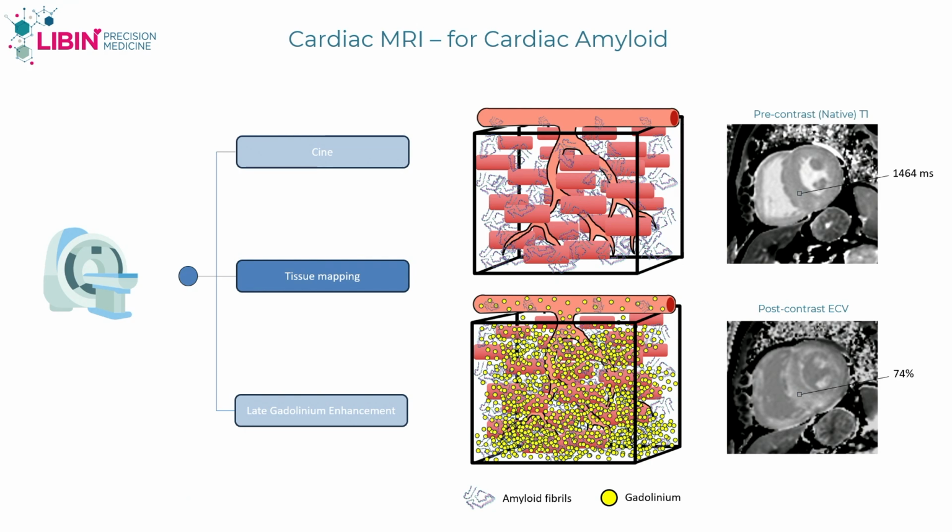And in this patient here, it should be around 25 to 30%, and I believe, I can't see it, but I think it's something like 70-something%. So a tremendous amount of amyloid protein burden. So we can use this to track response.